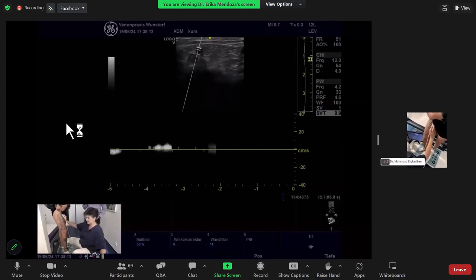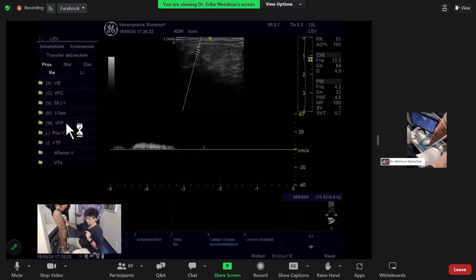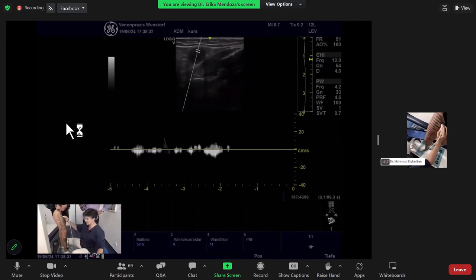And I go up to the epigastric vein. Lift the toe once and lower it. And here, it is not so clear, because as we know, in the epigastric vein, the normal physiologic flow is down. And so this one is just about a second. So I won't be so sure that this is the correct reflux source.